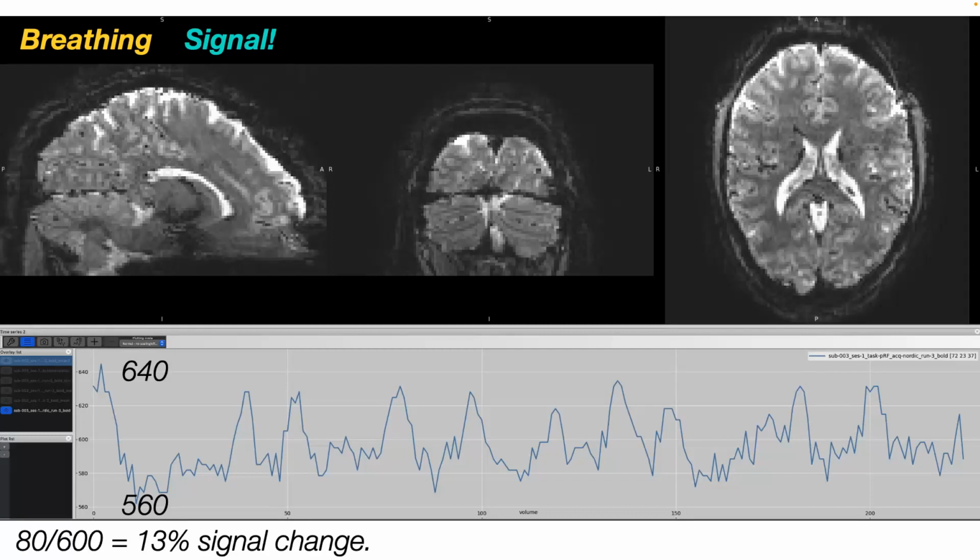I was so happy when I found this voxel because I thought it was beautiful. It's just a big vein, right? And it's likely this vein, and we'll go into the neuro part of that a bit more, like the anatomy part. But if you're sampling a vein, it's likely that it will just be pooling blood from a huge region into that vein. And so you're not looking at any specific measurement anymore. So you get a huge response, but it's not really the type of thing that's directly linked to neurons anymore.